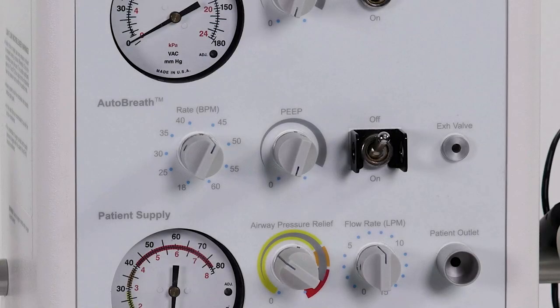The additional resuscitation module offers auto breath. The additional dials offered for auto breath are rate BPM control knob, PEEP control dial, on and off switch, and an exhalation valve.